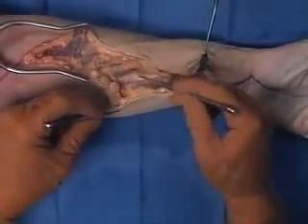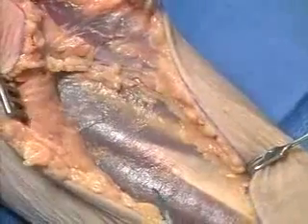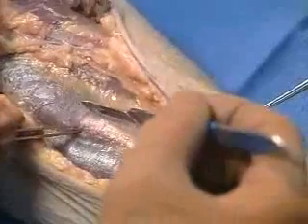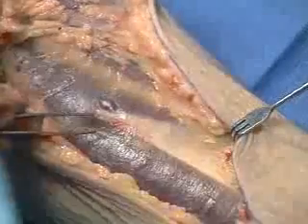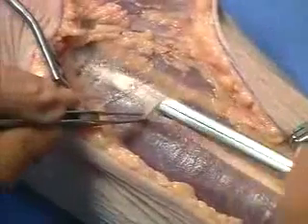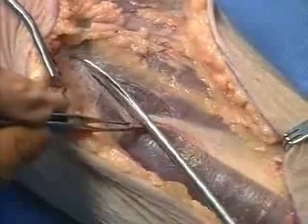volar or palmar forearm fascia. Then, starting with the anterior compartment, we're going to make a small incision in the fascia. Identify our fascia and then release our fascia.